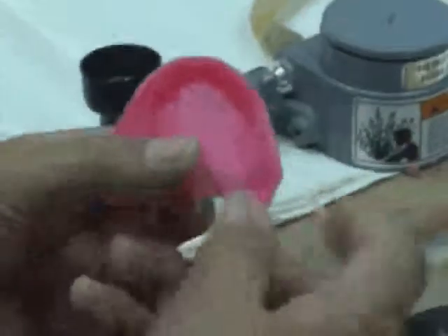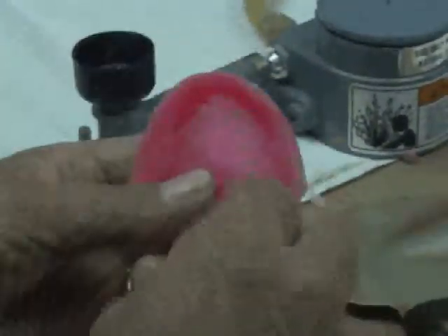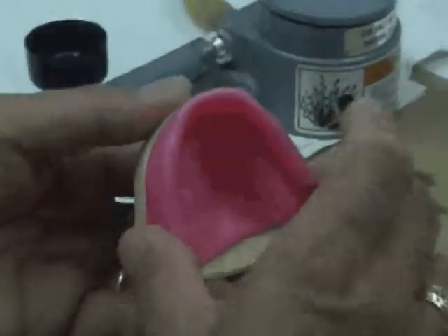Now we can tell we're right if the wax goes down from the mucobuccal fold. It should go pretty much straight down from there. We're going to put this back on the model now and mold it into place. And this is the starting of the aesthetic control base.